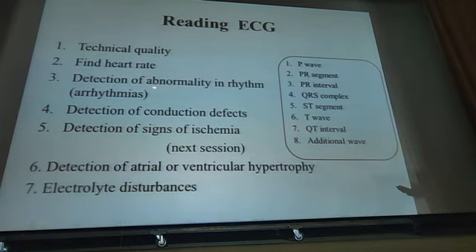Then detection of conduction defects, signs of ischemia or myocardial infarction, detection of atrial or ventricular hypertrophy, and electrolyte disturbances.